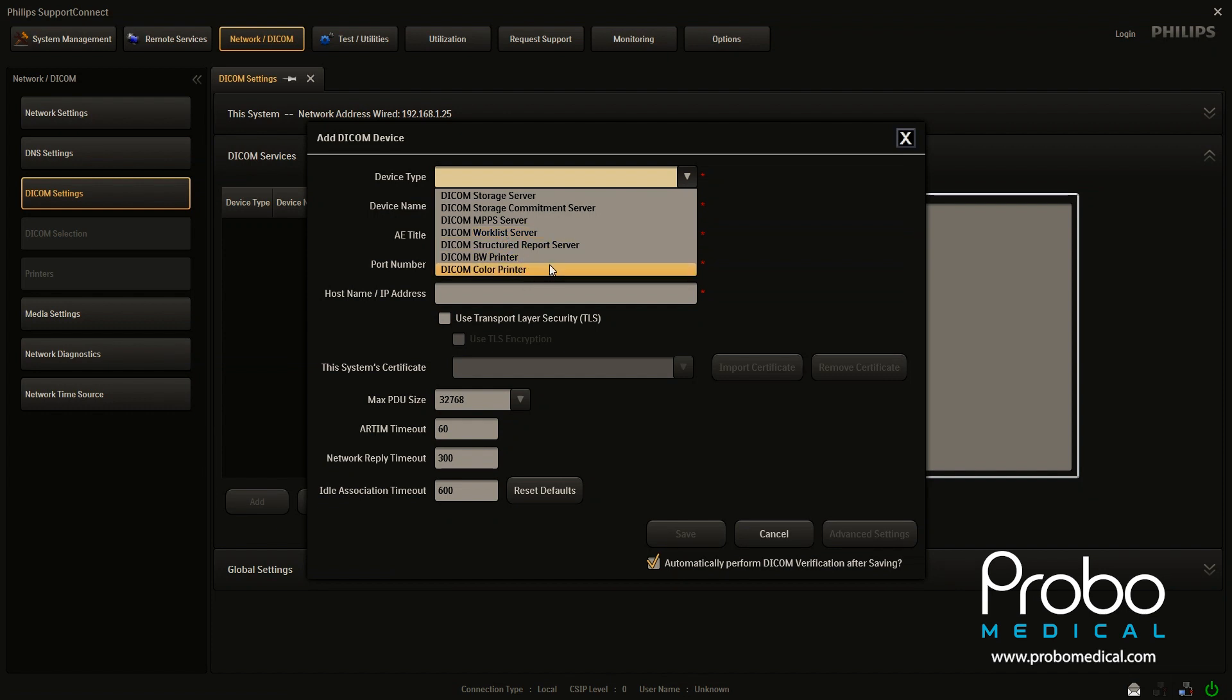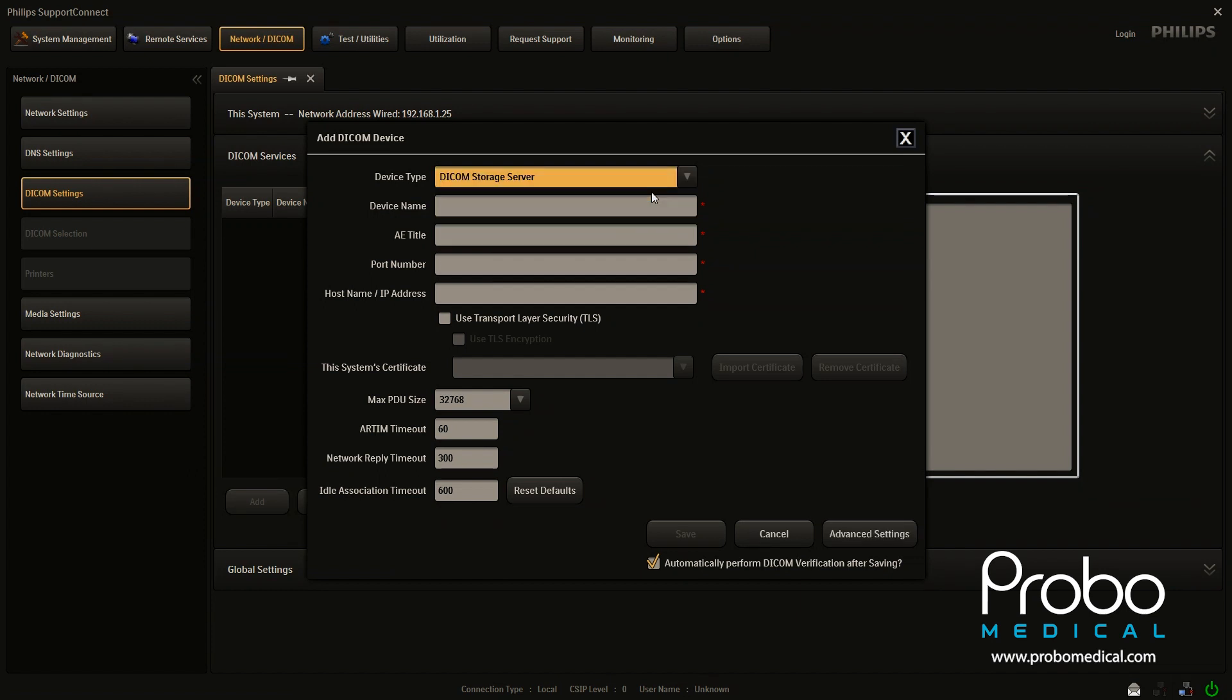We don't really see color printers or black and white printers being used anymore. So I would stay away from that. And rarely would anything called a storage commit server be used. So DICOM storage server is what you want most of the time.